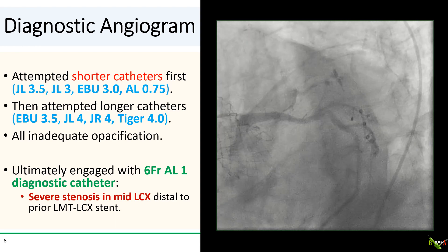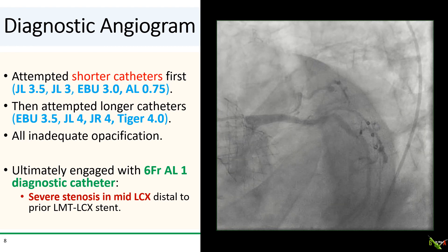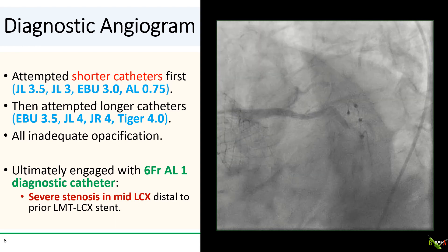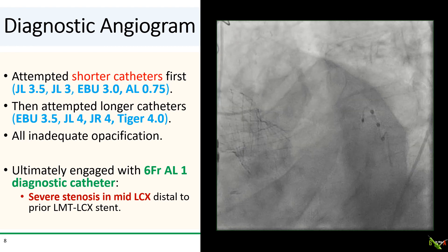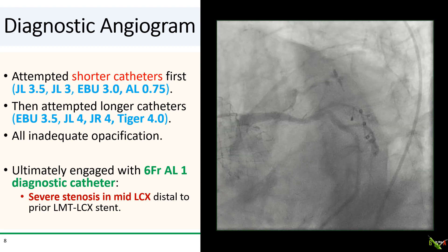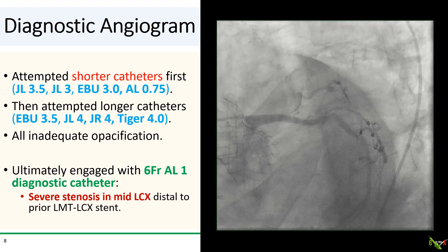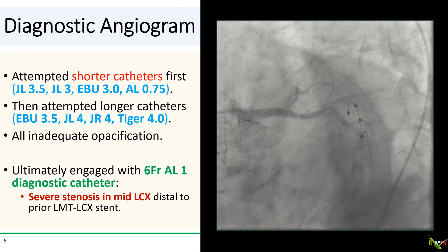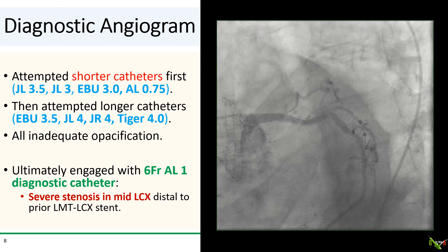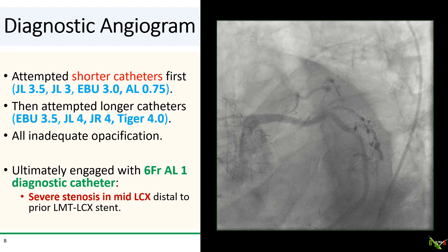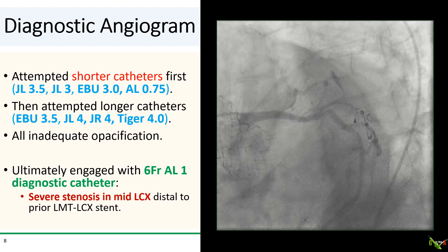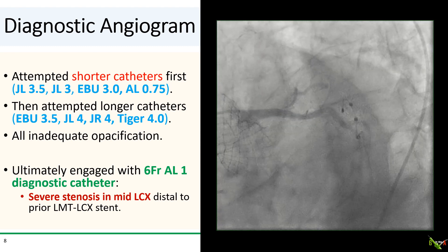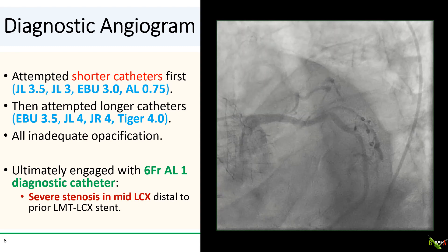A 6 French AL1 diagnostic catheter engaged the left main, albeit extremely tenuously. And here is what we see: there is a severe stenosis in the mid-circumflex just distal to the prior stent, and that was the culprit lesion, and it needed to be fixed.